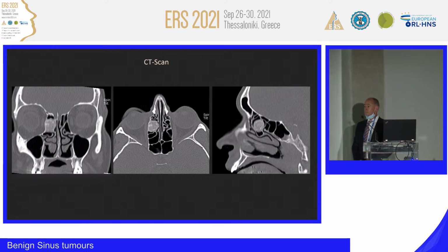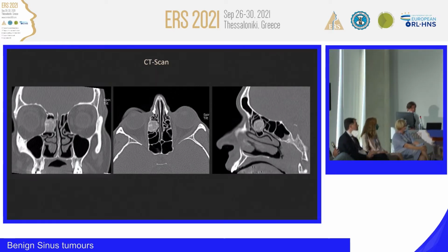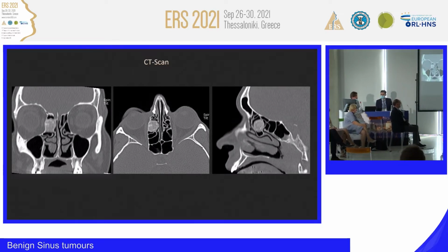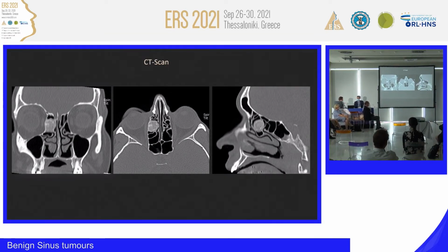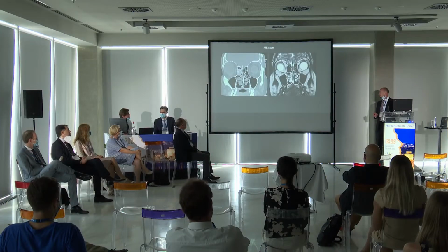Maybe ask if she had earlier in her life also a CT scan for a different reason of this region. Yeah, the patient, it was the first time she had imaging. So it's just image number 1. So, in fact, a nurse on our ward, something is there, a tumor. She was very, very worried. And we went for an MR scan.